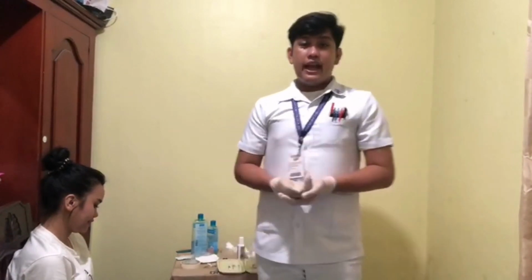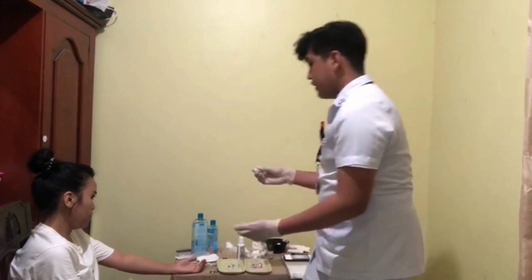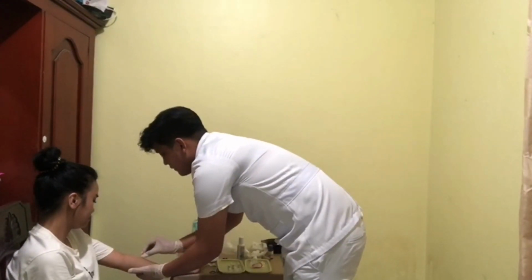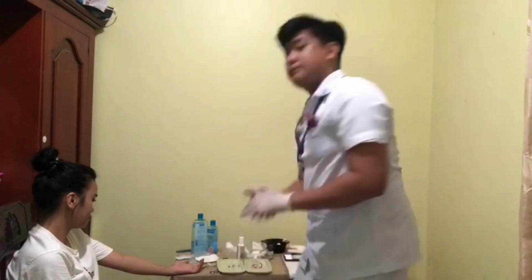Okay, so now, since I've already worn gloves, I am going to start. We'll now cleanse the skin at the site using a cotton ball with a firm circular motion. First, I am going to pick up a cotton ball and then apply it in a circular motion. Okay, and then discard the used cotton ball.